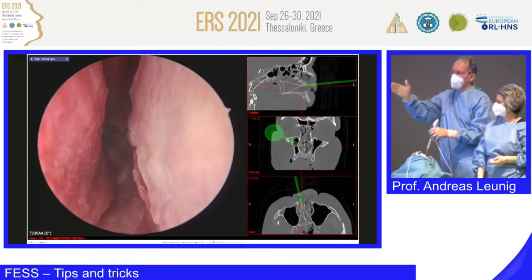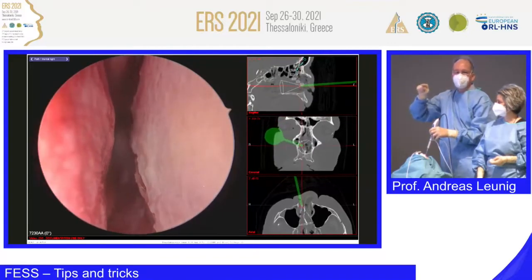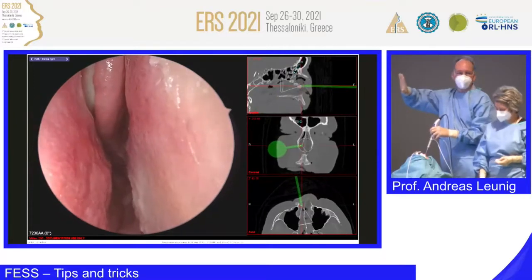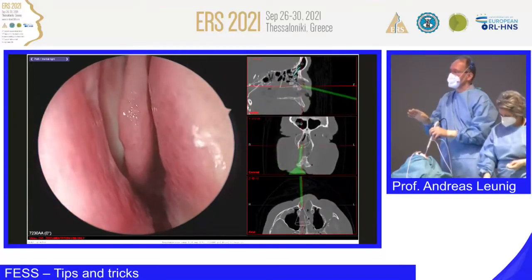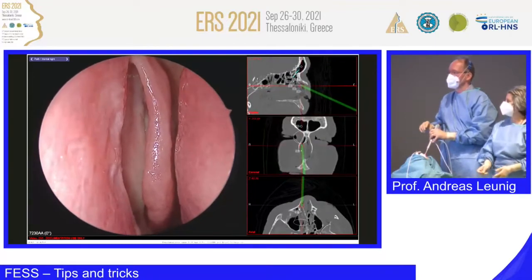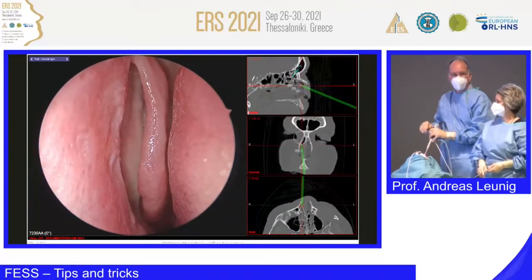You won't see anything, maybe a little groove, but not more. So we will put some gel foam on this, and that's it. We don't have to do more. Okay, now let's come to the middle meatus and to the first steps about FESS.